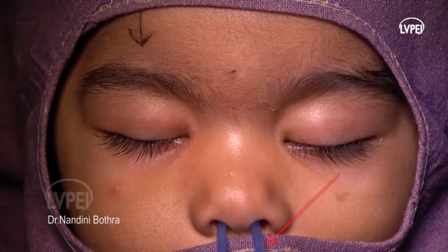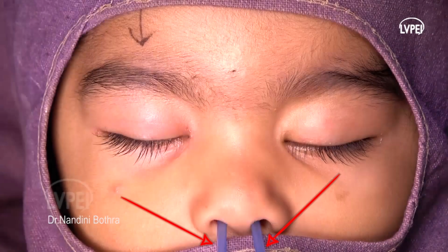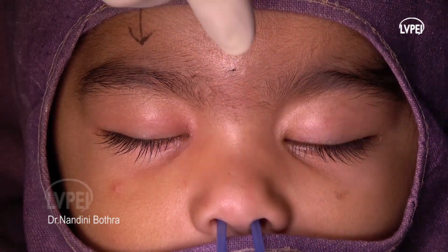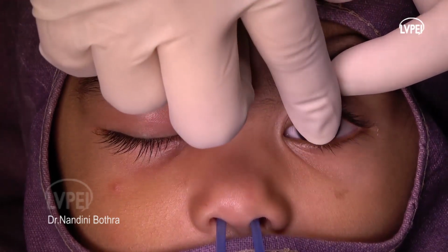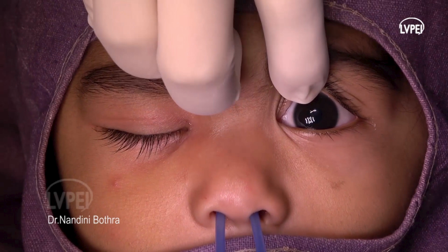Nasal mucosa is decongested with cotton buds soaked with 0.025% oxymetazoline. The upper eyelid on the unaffected side is raised at the junction of the medial and the middle third from the margin such that the area of the punctum and the horizontal canaliculus is visible and is taut.